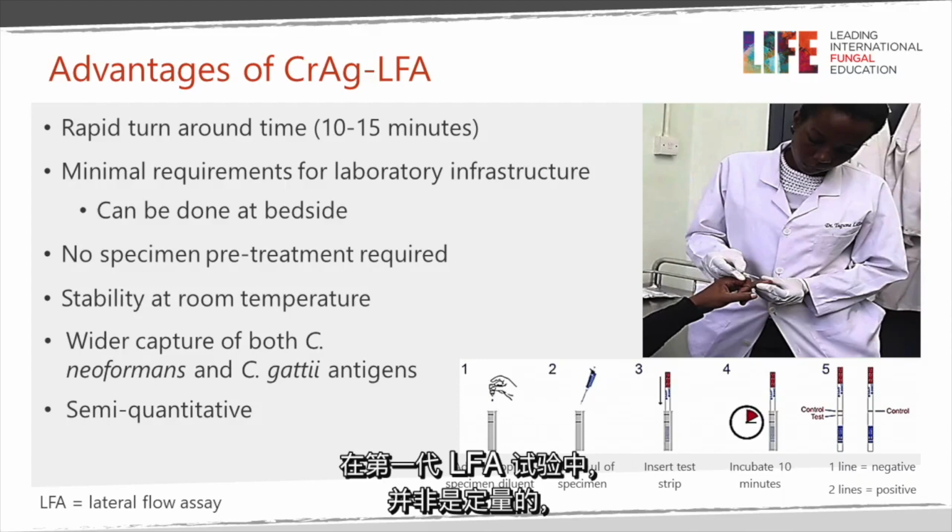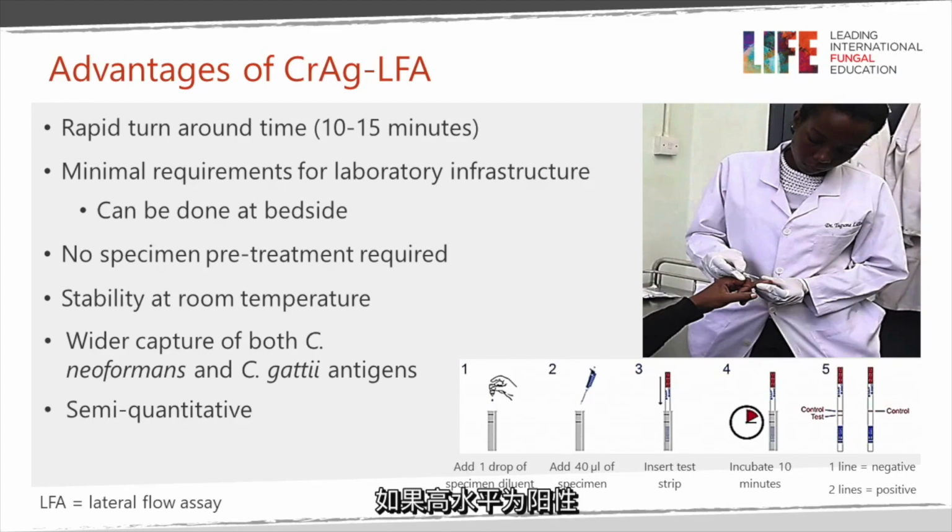It's not quantitative in the first generations of the LFA tests, but the more recent ones have got a double band which shows two different levels of positivity. And if the higher test is positive, then that usually means the patient has meningitis.